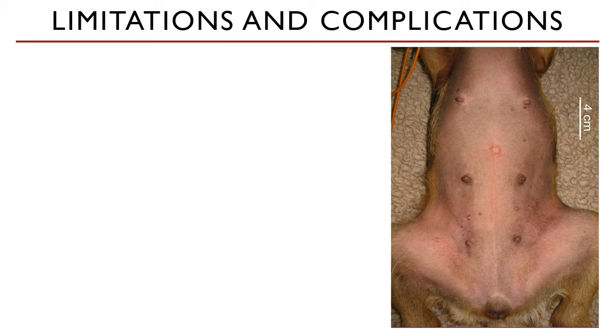However, this procedure still comes with its limitations and complications. One limitation is when we blindly tap the abdomen and do not get any fluids. This is what we call a dry tap. Unfortunately, a dry tap does not mean that there is no abdominal fluid, and you were wrong when you thought that there is.